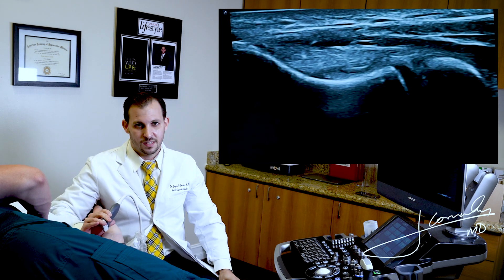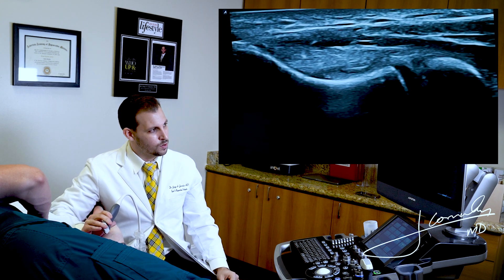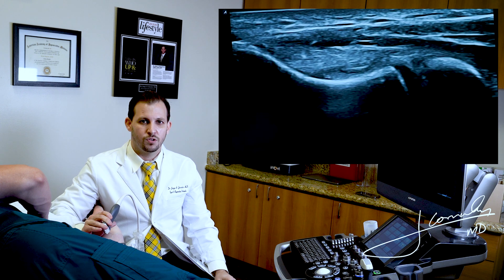At this level, we could see if there's any tears, if there's any calcification. Sometimes we see that in overhead throwers, and we could get a pretty good picture of the ulnar collateral ligament.